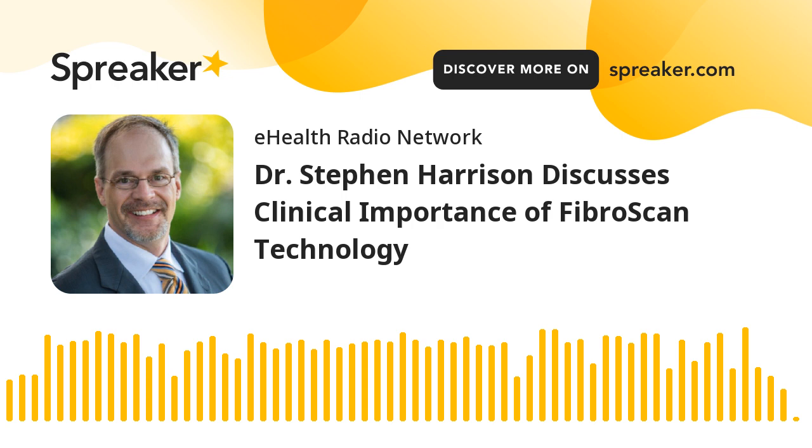So FibroScan is a device that uses ultrasound-based technology to identify both fat in the liver and then stiffness, which correlates with the scar tissue or the scab that's developing in the liver. It takes about 10 minutes to do. It's simple. It's non-invasive. And it's something I use in my clinical practice every day. In fact, I call it my sixth vital sign. I don't see a patient without a FibroScan because it tells me two very important variables.